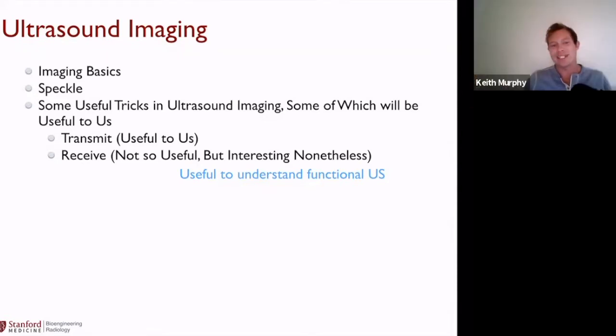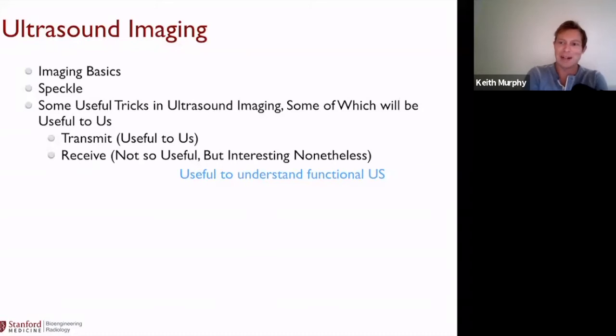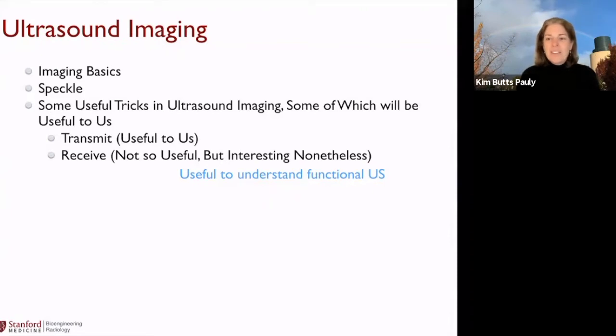Yeah, I would take it back in even a couple ways. Like we've seen grants and proposals for using imaging within a transmit probe, like in a therapeutic probe as well, too, right? I mean, it's starting to happen. Yeah, so absolutely. That's absolutely right. A lot of ultrasound devices for therapeutic ultrasound have like a ring array that's the therapeutic part, and the center part is an imaging part, right? Yeah, so we'd be depriving you if we didn't teach you a little bit about imaging, and I think it'll be useful nonetheless. I agree with you, Kim. Okay, all right. Well, let's now just get into last year's lecture on ultrasound imaging.